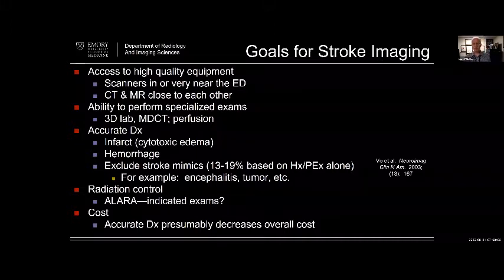So you have to think, okay, that's part of the differential diagnosis. To wit, whenever I read a head CT or a brain MRI and somebody has a cortical interruption in the supratentorial brain, maybe a prior infarction, I try to remember to mention that if they're having seizure, it could be related. And so, for example, somebody who's presenting with what is probably my least favorite in terms of histories, altered mental status, scourge of modern times, maybe they're seizing. I think they have that part. And of course, infections and other things can do it, other forms of encephalitis, depending on the presentation. So stroke mimics are definitely part of it.